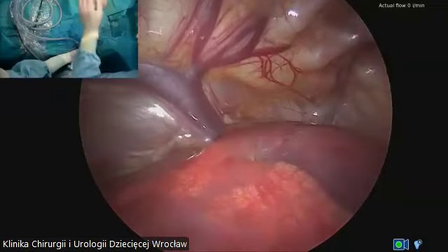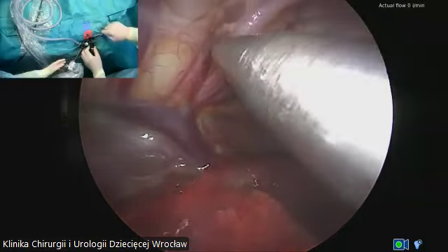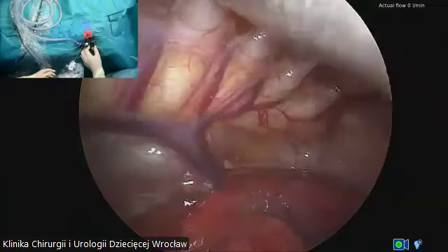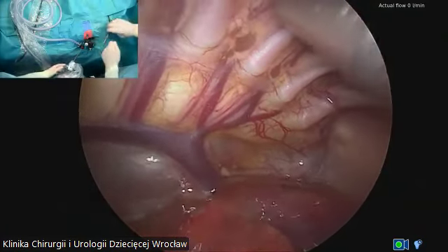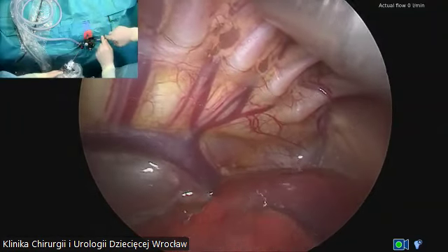Probably the fastest way is to clip the fistula. But the only problem is that you need to use a 5 mm trocar. We will check if you have a problem, we will exchange it to do it faster.